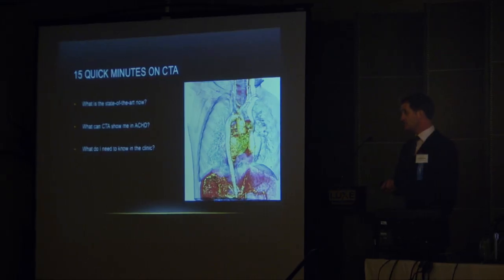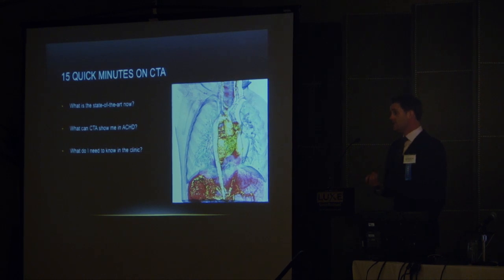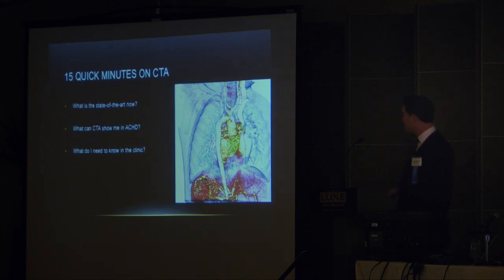But over the next 15 minutes, we're a disparate bunch here. We've got some surgeons, some physicians, nurses, interventionalists. And what I'd like everyone to be able to have at the end of it is to say, look, I know what the state of the art is in CT at the moment. I want to be able to know what CT can offer my patients with congenital heart disease. And then finally, if I'm thinking about ordering a CT in the clinic, what do I need to know for my own patients when they're asking me different questions?